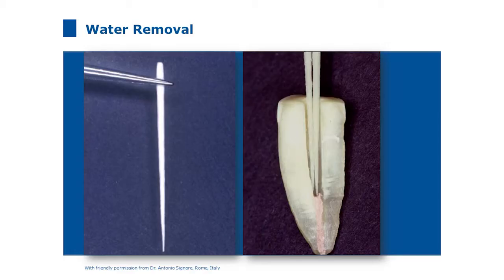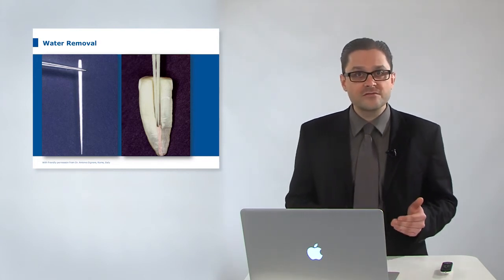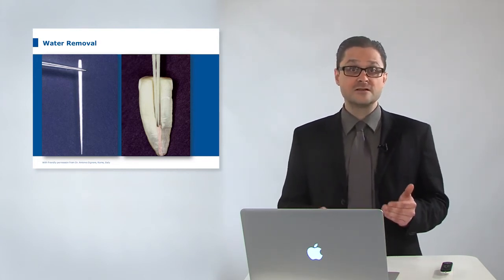To create a humid film, the brush and tissue technique offers a predictable outcome. The dry brush is inserted in the root canal and then checked step by step on a tissue to see if there is still excess water. The brush is dried out totally again on the tissue before the procedure is repeated. If there is no humidity left on the tissue, you can go on with the bonding procedure.